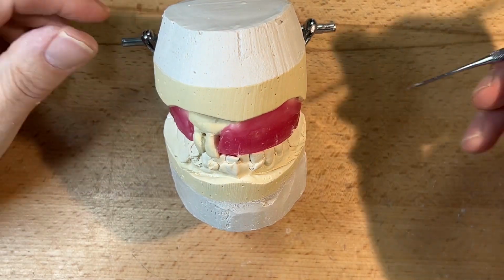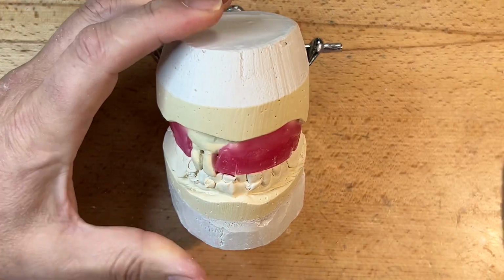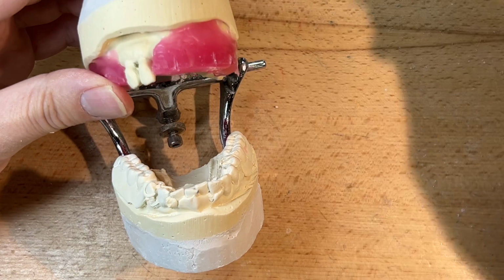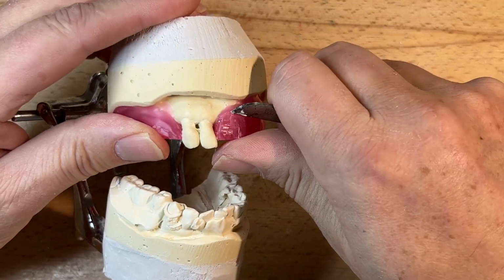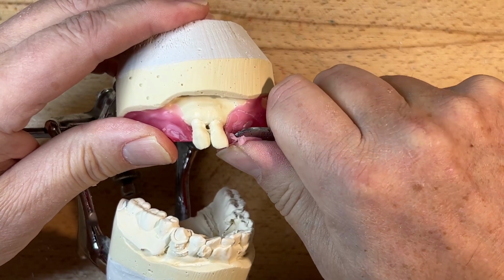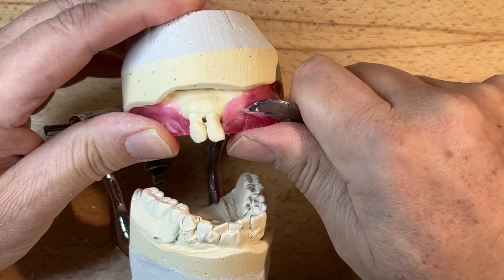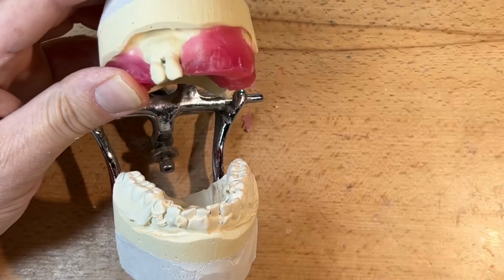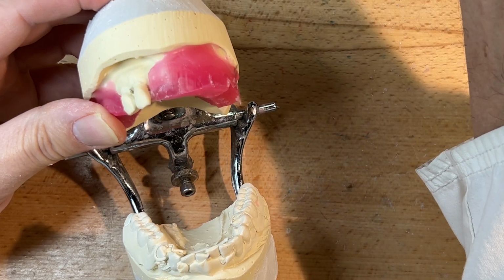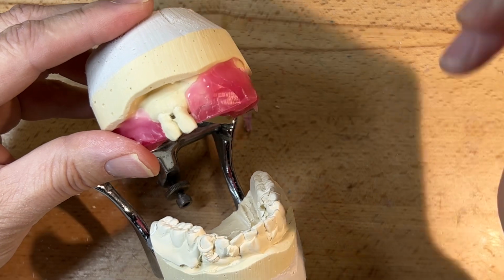When we go to a full denture, I've seen many immediate dentures try to have a 90% overbite, which is definitely not helping the client with any kind of stability in their complete upper denture prosthetic if we are incorporating 90% overbite, unless they have a condylar inclination of maybe something extreme, like a 50-60 degree condyle, which is really rare.